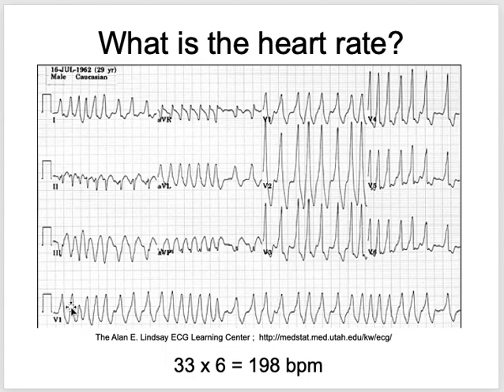This is a long recording. They record lead V1, a long one, to check for the rhythm and things like this. See, everything is different. There is a very short distance, a very long distance. So simply, this is how atrial fibrillation looks like. The QRS complexes are irregularly placed, right?